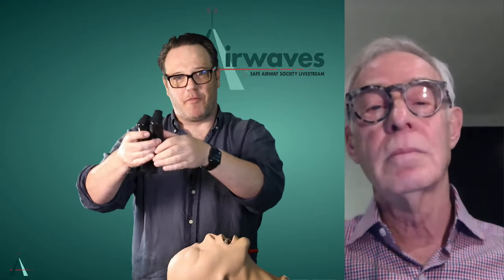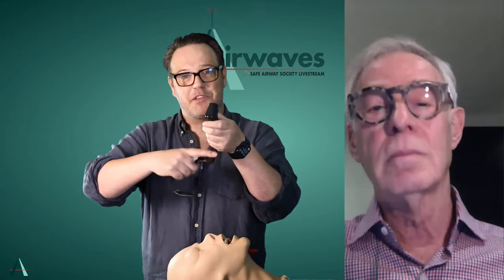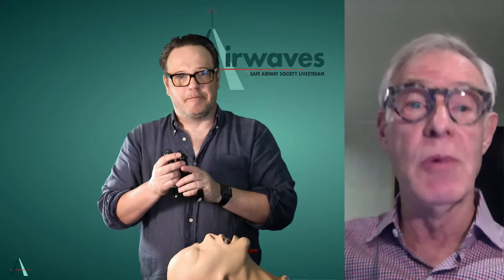So I think, if I'm right, Richard, what you're saying is, because my argument was, with the longer blade, if I put the tip in the same place, what's the difference? But what that means is that there's a lot more flat blade in there. I'm getting less access to the hyperangulated blade, which is what I'm trying to use it for. And you tend to be looking behind again. That's my feeling as well.